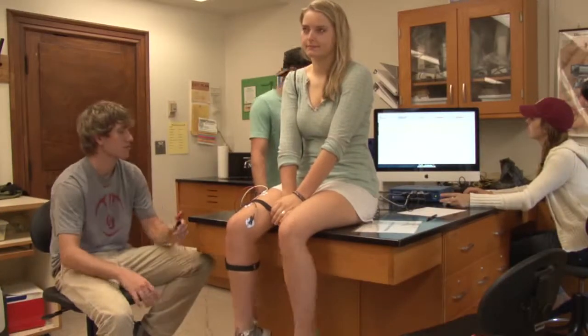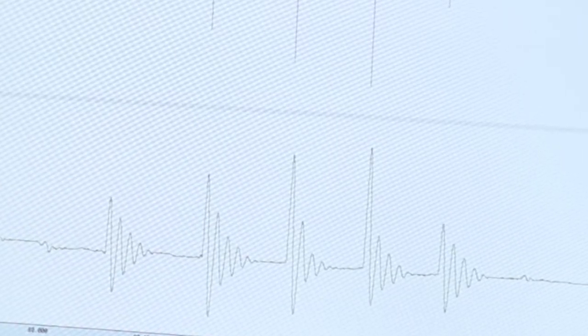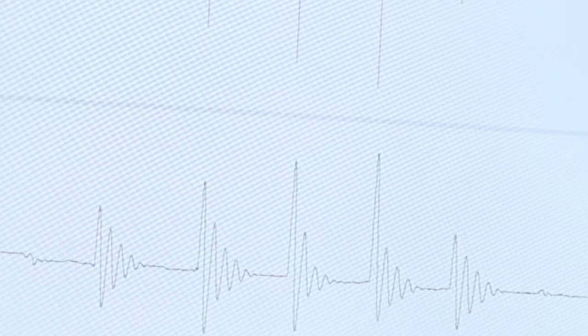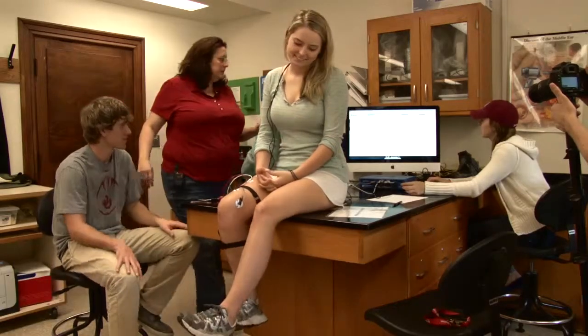So computer operator and helper, it's your job. When you see 3 or 4 good ones in a row, it's up to your judgment to stop. I mean, you can go as long as you need to, but if you get 3 good ones first time out, you're done.